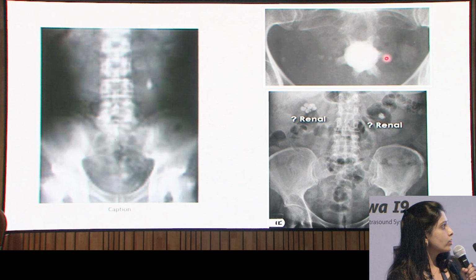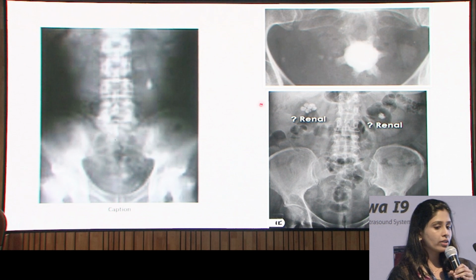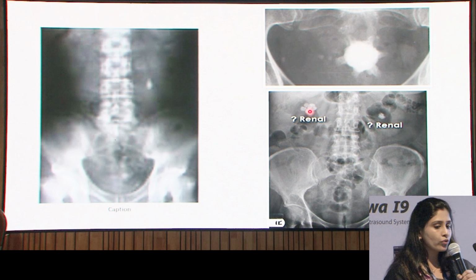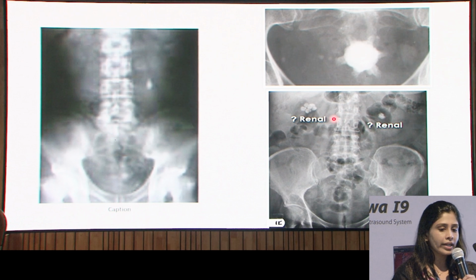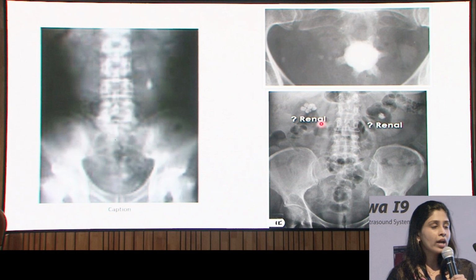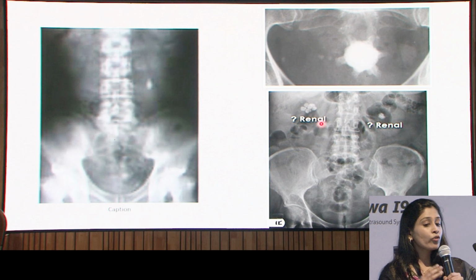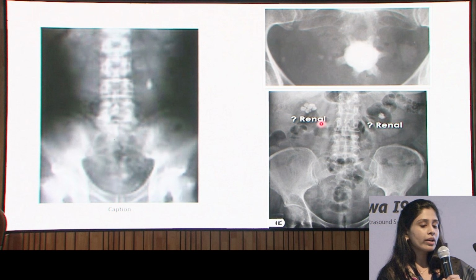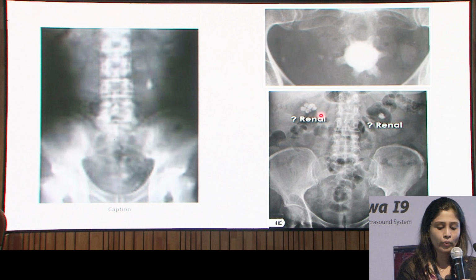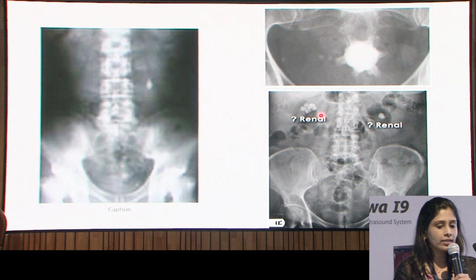Coming to the lower image, we can often get confused whether it is a gallbladder stone or a renal calculus. So let me tell you that usually 10 to 15% of gallbladder stones are radio-opaque. They are more often rounded in nature and are clustered together unlike renal calculus. One thing we can do here is take a posterior-anterior or antero-posterior radiograph. As we know, the more the distance of the object that we are imaging from the film, the more is its size. So when we image a gallbladder stone on an AP radiograph, it will appear considerably larger in size. So that's how we can differentiate. But anyways, we go for further imaging with excretory urography and NCCT.